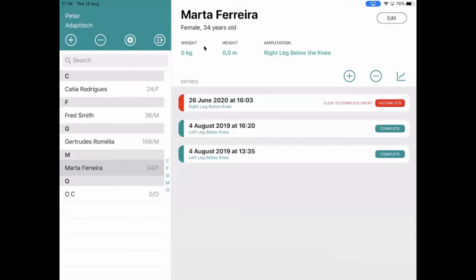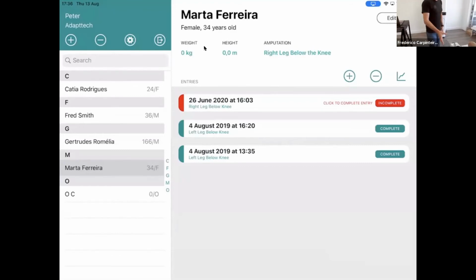Okay, so basically, as I told you, the first step is to get the socket. You verify first of all the type of strips that you'll be using. So for example, in this socket, I'm going to use 2 strips of 8, 1 on each side, and 2 of 4, 1 on the back and 1 on the front. I'm going to connect the strips to the wearable, turn on the wearable, and connect the strips just to see if they are good to go. So only blinked once means that it's okay to use.